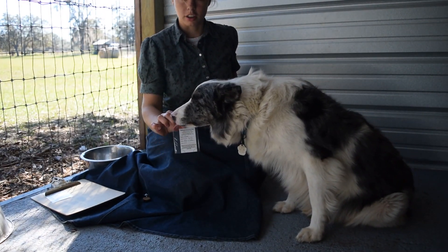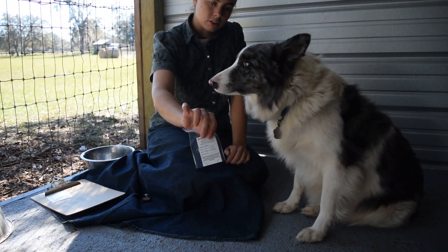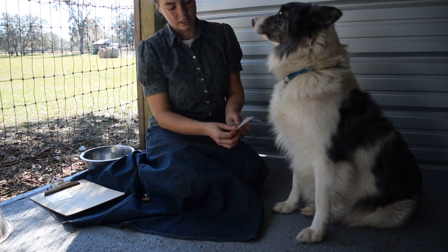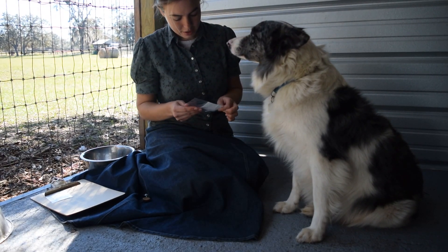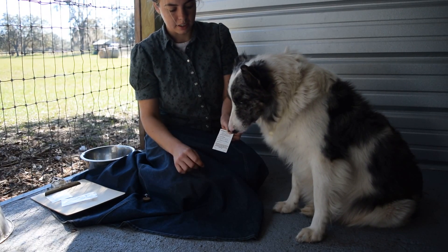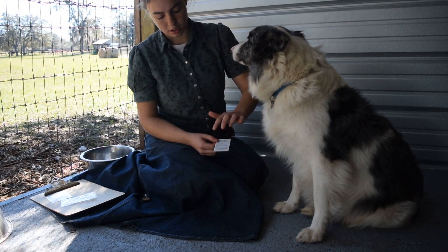They're located in Florida, but you can ship to them from wherever. They send out these little permacode cards, which have a spot for the dog's name, the owner's name, and what breed they are. And then down here there are little spaces to put the blood.